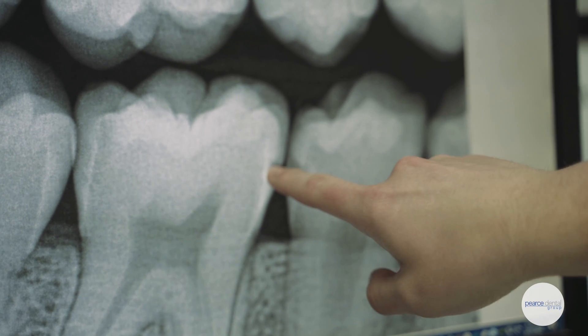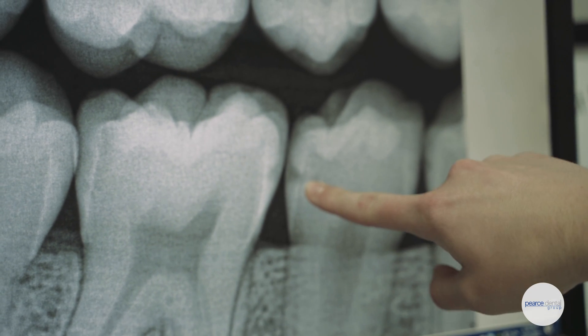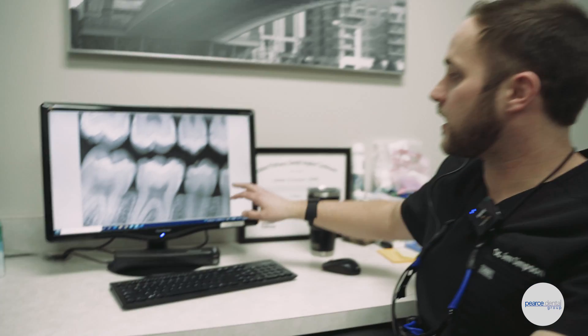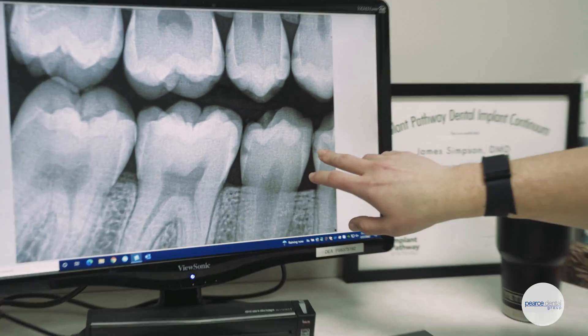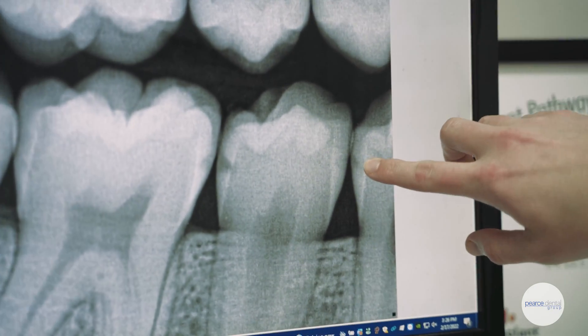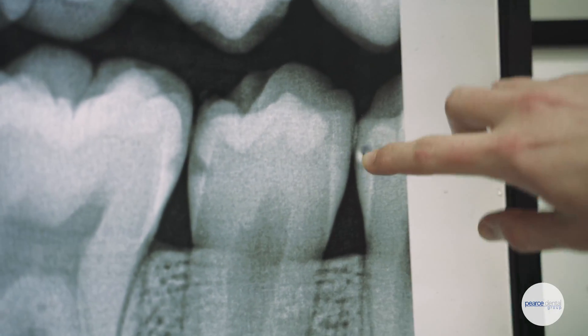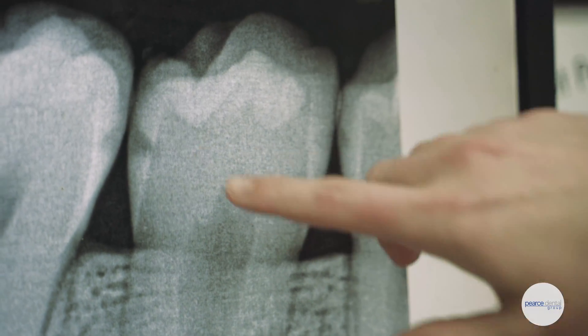Occasionally we can find what's called an incipient cavity — essentially a very small start of a cavity that's not actually active. On the x-ray, it's typically a little bit smaller. It may still be a little dark in color, but it doesn't quite penetrate that enamel bar we talked about.